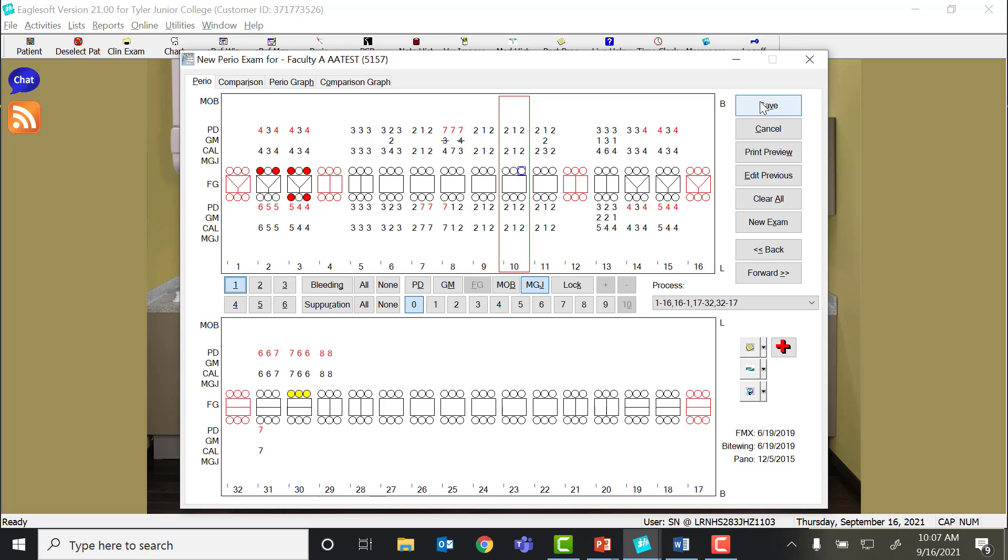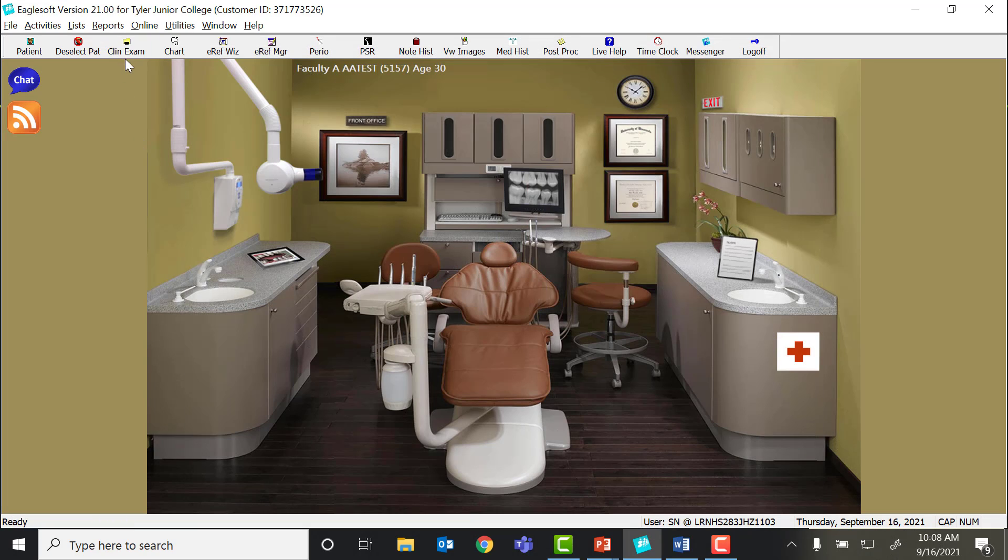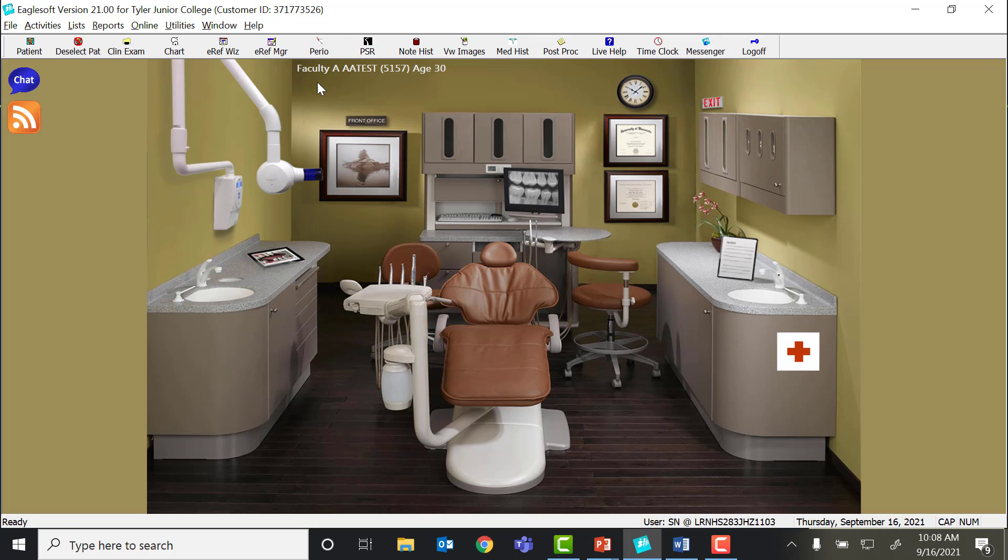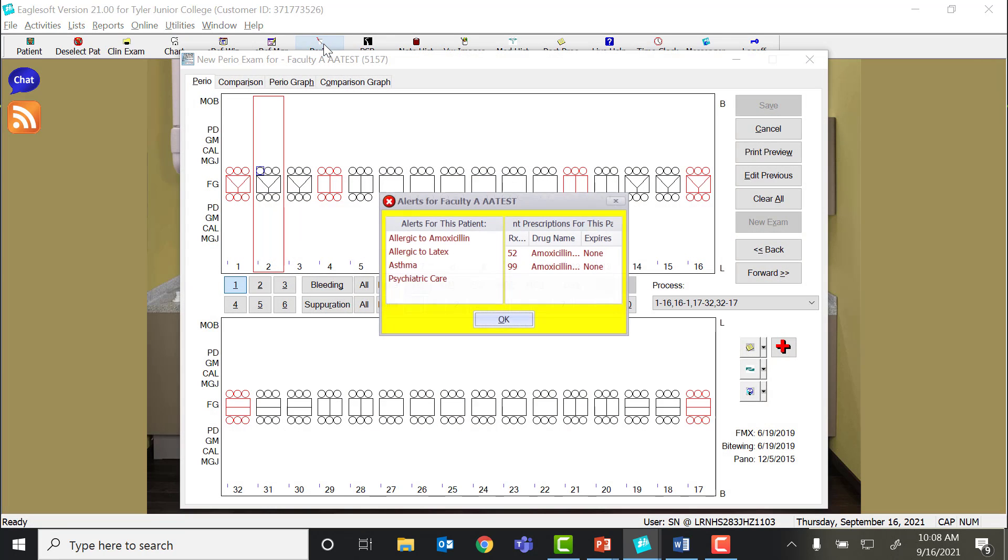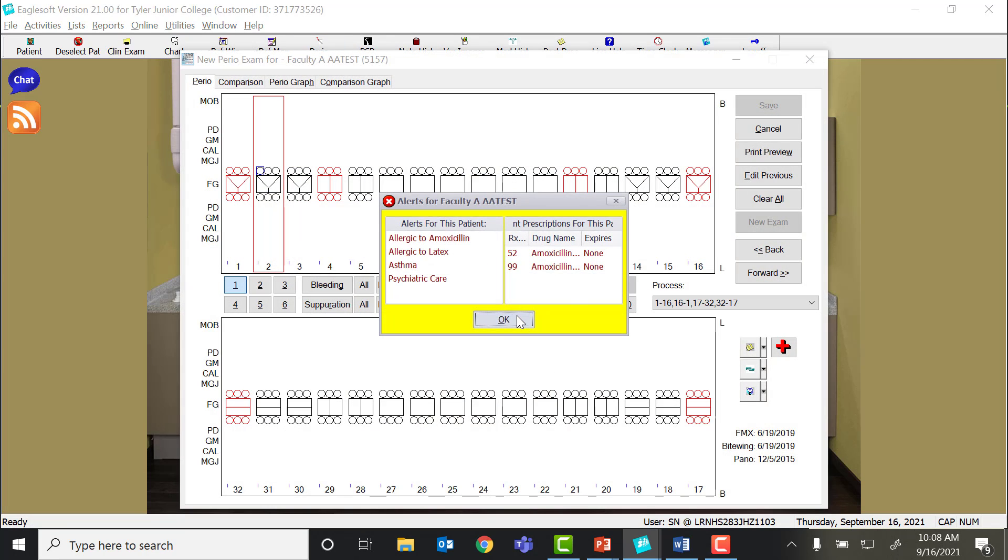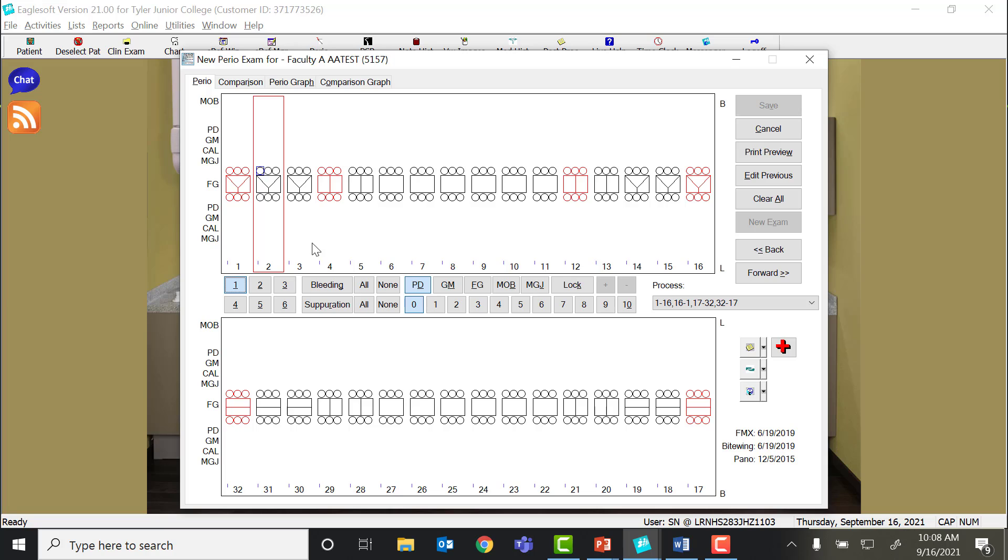You will want to save your exam, and then you are good to go. So I'm going to kind of do this again and show you what a completed probe chart will look like. Again, I've removed the teeth that are missing. I'm going to click my perio tab.